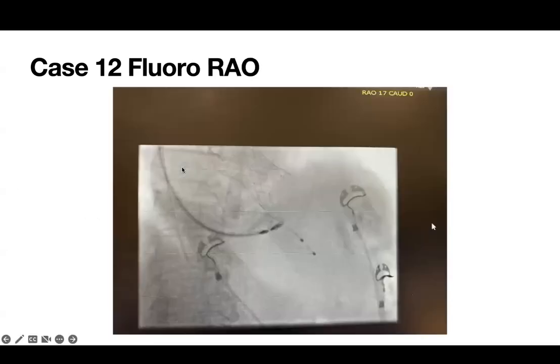Yeah, this is my last slide. I was just going to show it here too. In RAO 17, the TVP was in place. I had placed it here. So during the case, I knew there was an R prime because I positioned the V1 low. The post-op ECG, when I was finished, I saw in the CVICU, there was no R prime on it. And I said, okay, I positioned it lower. So just my last point, like you said, also in the hybrid lab, if they put it super high and you have no R prime, the location of V1 is really important.